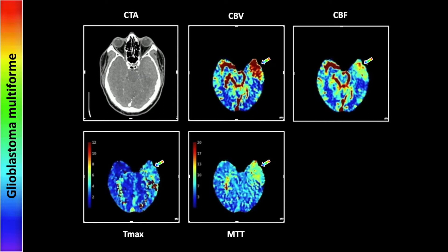Let's look next at a glioblastoma multiforme. We have two screenshot levels for this one. The lower one actually shows the soft tissue component of this tumor, and consistent with that you actually see an increase in blood volume and CBF in the region of the actual soft tissue component, most likely related to hyperperfusion typical of neoplasms. The MTT here is actually slightly increased as well, which may represent the effect of neovascularity.